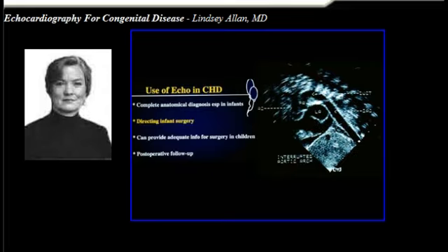And here we have a nice echocardiogram that shows us the anatomy of an interrupted aortic arch. We're seeing the origin of this small aorta here branching into two at the top of the ascending aorta. Here is the descending aorta being supplied by the duct.